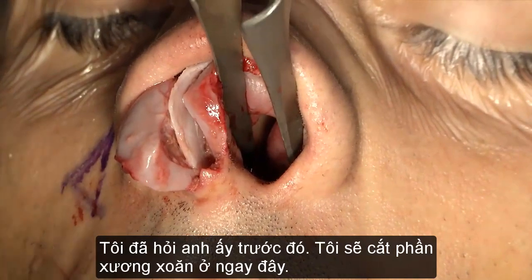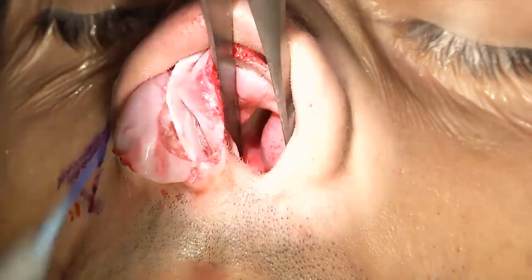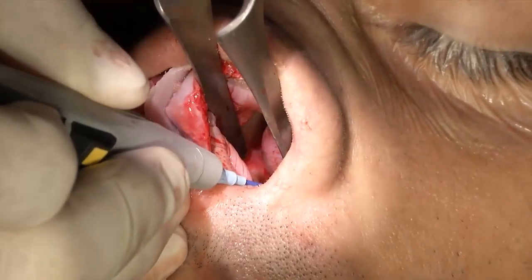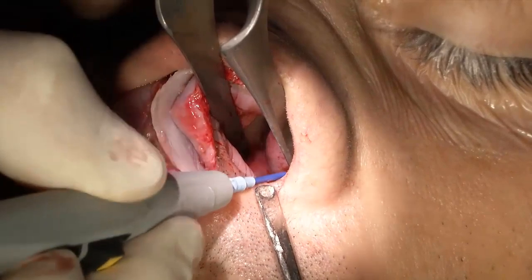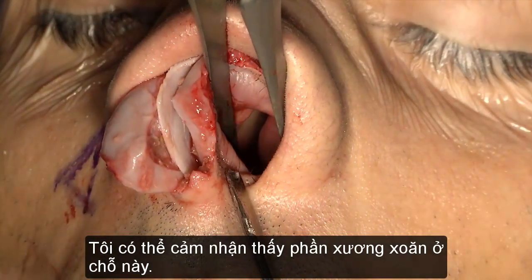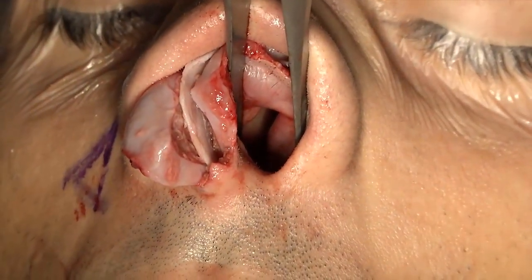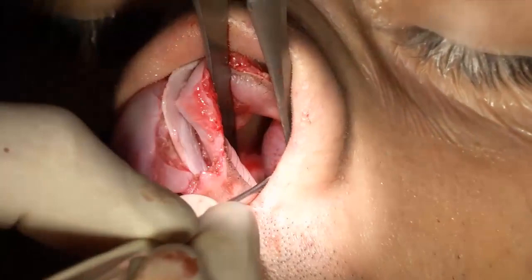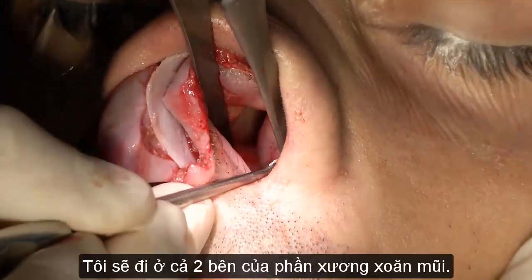So I was asked before about this. I just do electric. A cut here. Increase the coag. I'm feeling the turbinate bone actually. Okay, hold it still. I'm going on both sides of the turbinate bone.